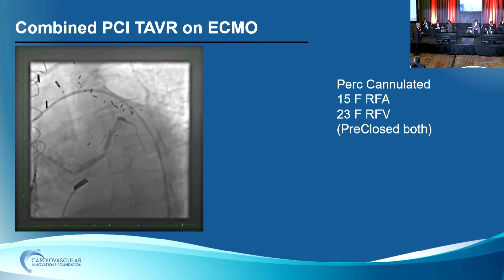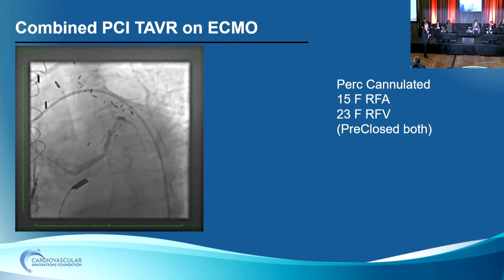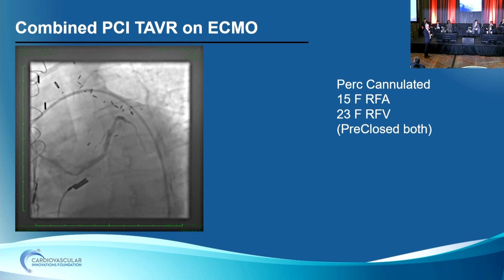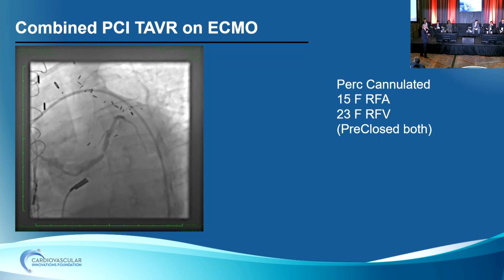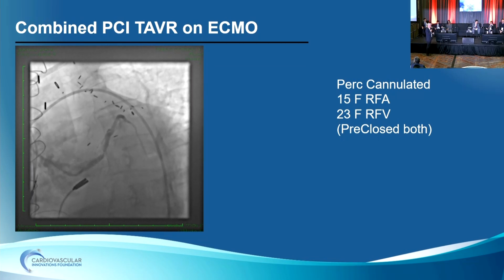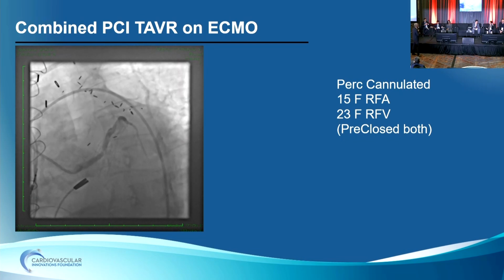Now does the plan change at all? Just in the few days, I think it was 3 days from that prior cath to now, there's no flow in the circ. Essentially no flow. And you've got the whole TAVR team waiting for you to do your thing, right? So what do you do first, the TAVR or the PCI?